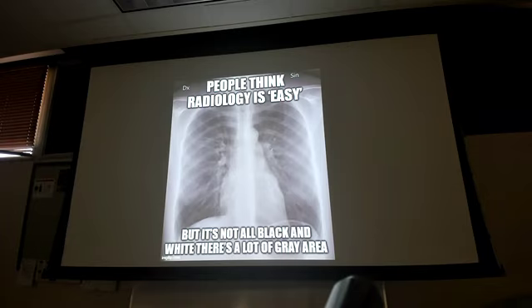And that's true though. It is a lot of gray area because you're interpreting things. You're going to interpret these images as an adjunct, right? Very rarely are you ever going to make a diagnosis based off of imaging alone. It's a gray area. I think this is what's going on. This is what the patient told me. This was my physical exam findings. This is what I'm diagnosing.